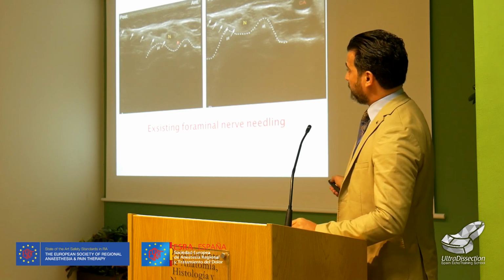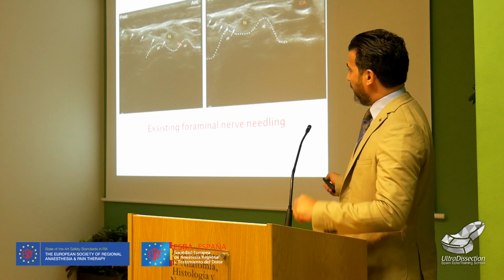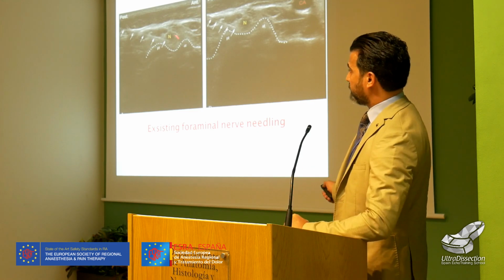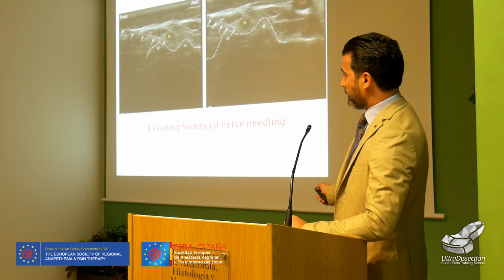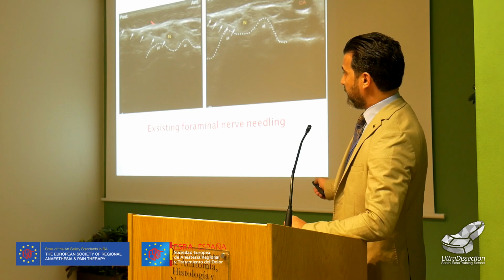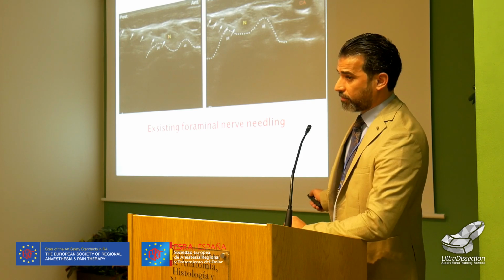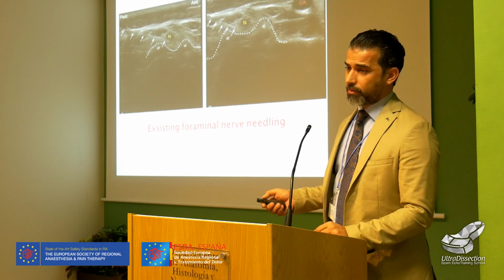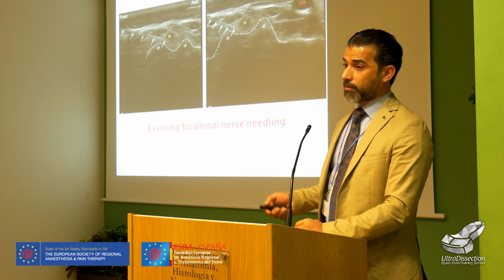Here the guide is to put it before the nerve goes outside, because here you can catch the dorsal root sometimes, as you are so close to the exiting dural sleeve. The injectate can go inside, and sometimes you also block the medial branch of the facet joint. You can also block the dorsal branch, not just the ventral branch, and the effect will be augmented.